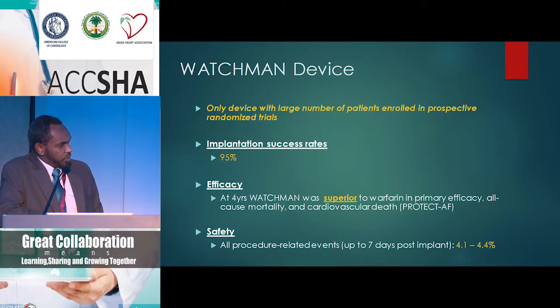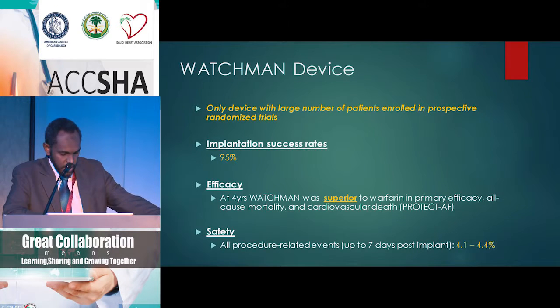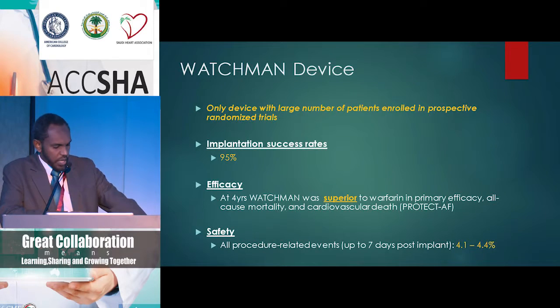Safety-wise, procedure-related complications occurred in 4.1 to 4.4% of patients. Initially, with the first trial that came out, the PROTECT AF, the incidence of complications was a bit higher because of the learning curve, about 8% or so, and then it got down to 4.1 to 4.4%.